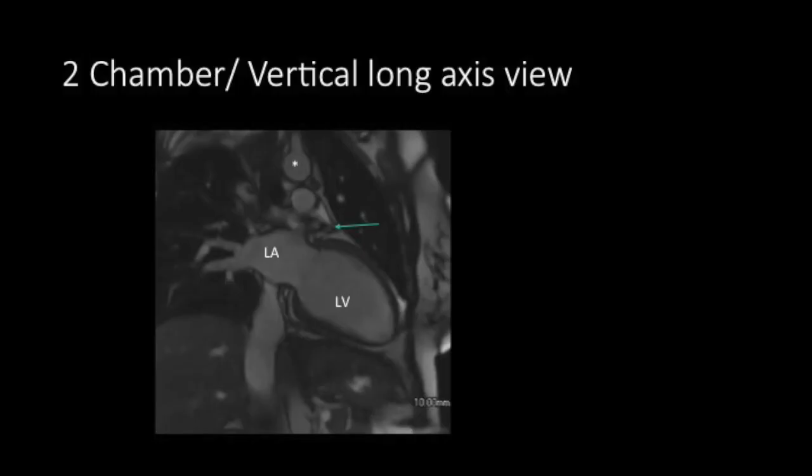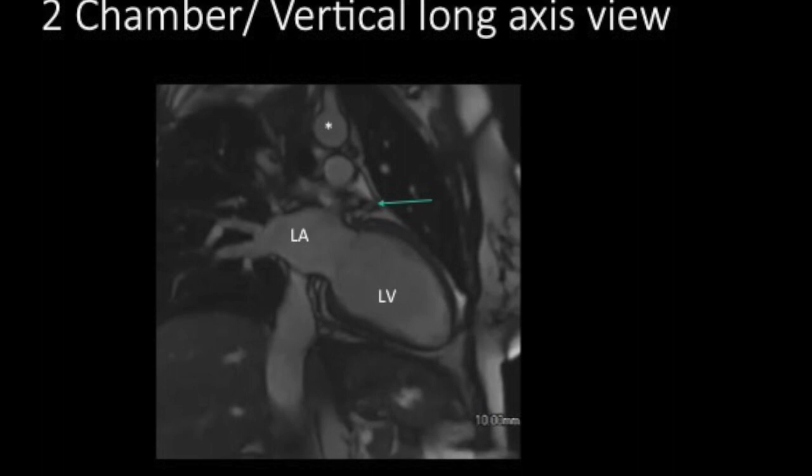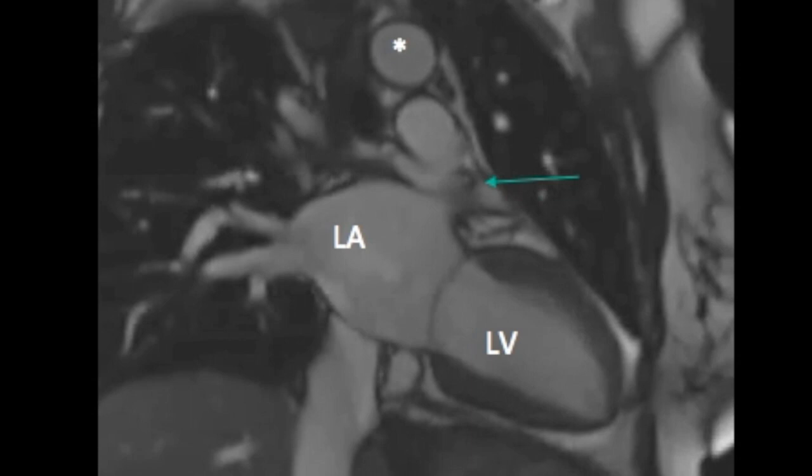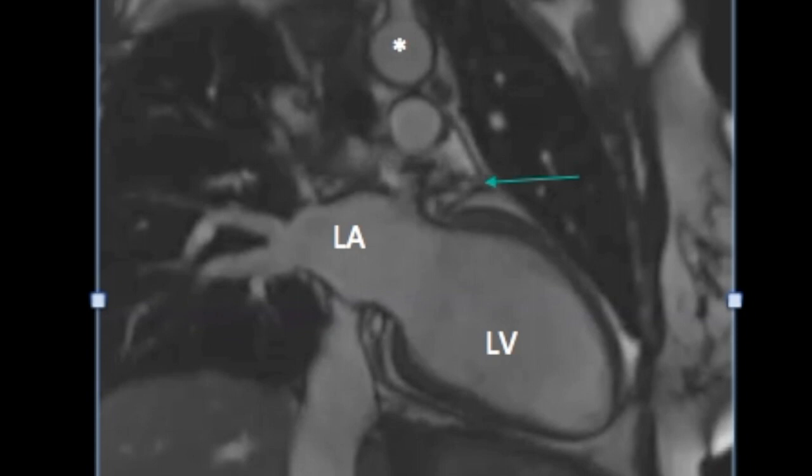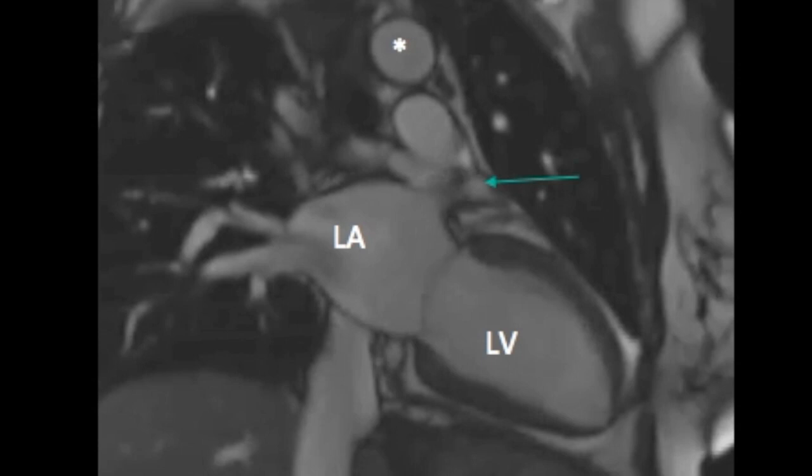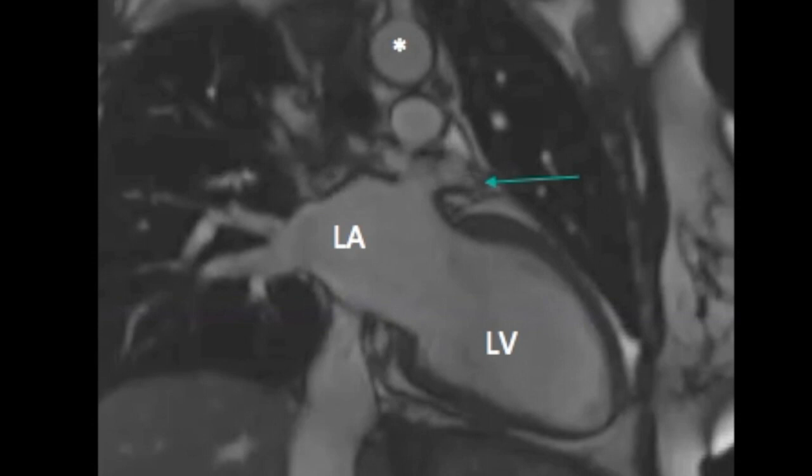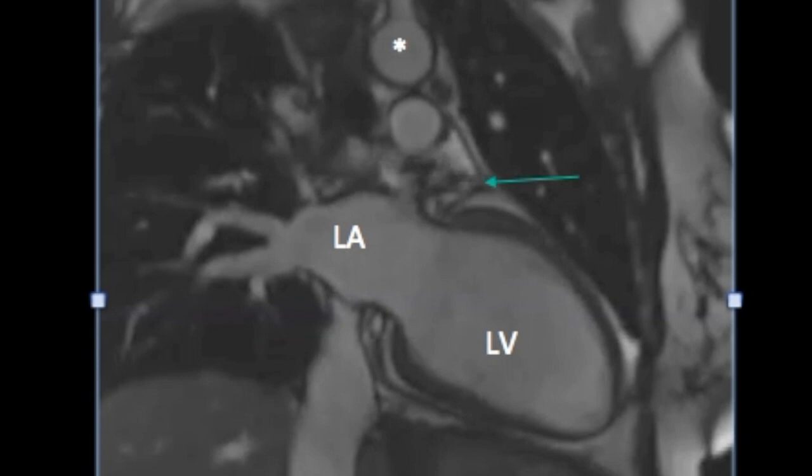Now let us look at the two chamber or the vertical long axis view. This view is obtained to look at the left atrium and the left ventricle. We can see the pulmonary veins draining into the left atrium. We can see the anterior and the inferior wall of the left ventricle. We can assess the wall thickness and the motion or any wall motion abnormality or the contractility of the left ventricle. We can also look at the mitral valve in between the left atrium and left ventricle and look for any valvular pathology.